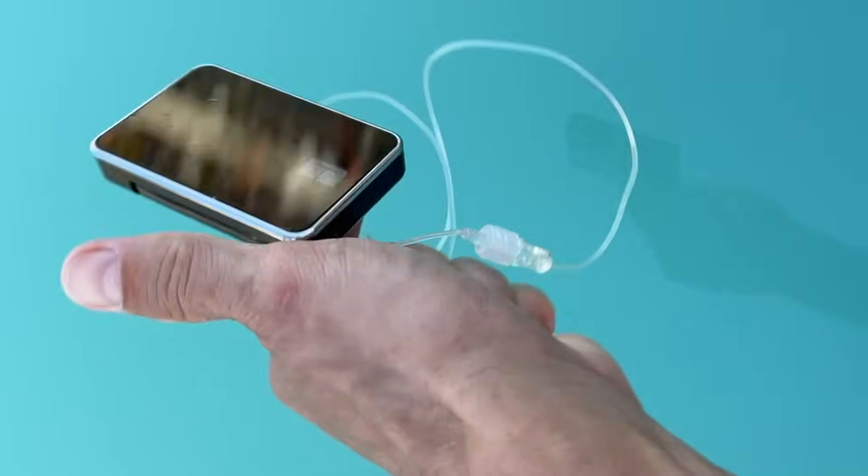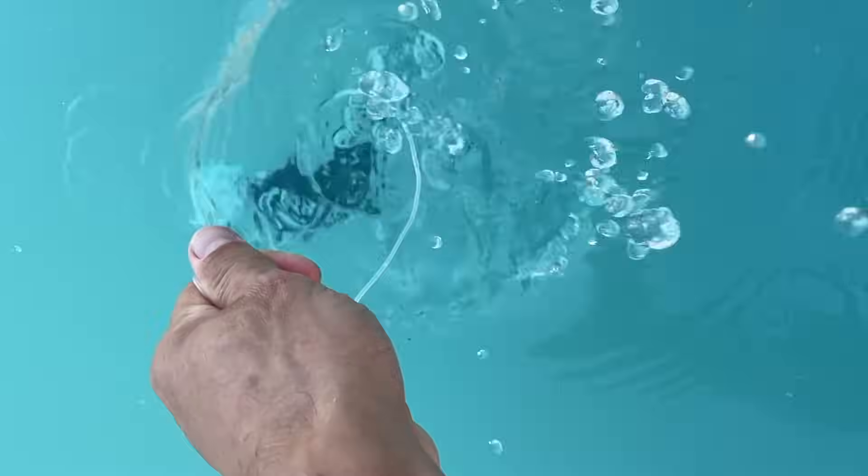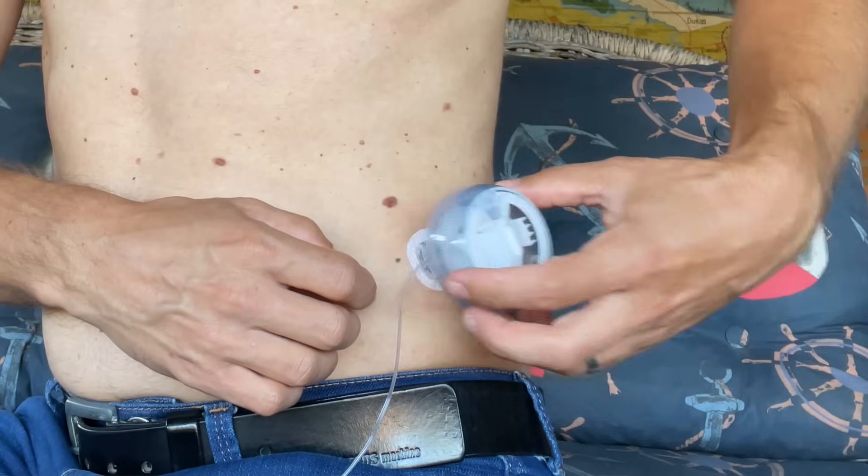I used this pump for over two years and in this video I'm going to share with you what else it can do, why I absolutely love it and why I totally hate it. And I'm going to share a few things that nobody is talking about but I find them super important when choosing an insulin pump.